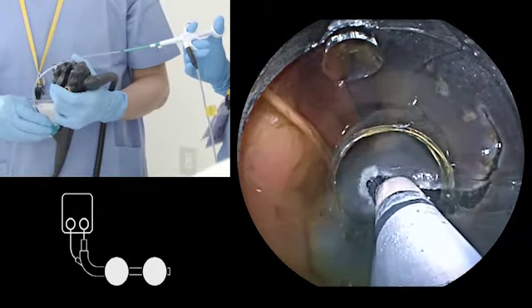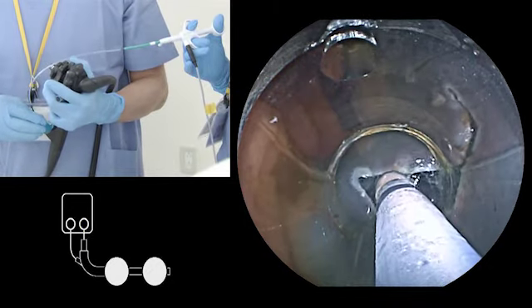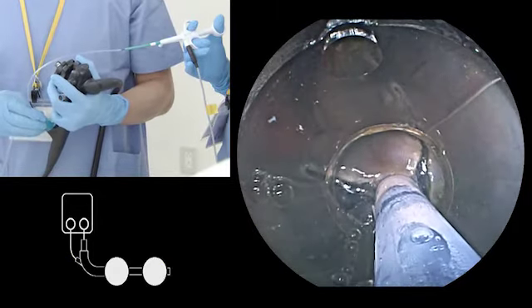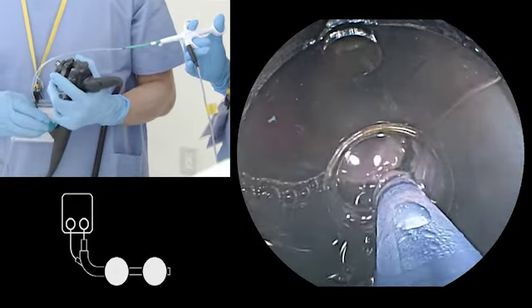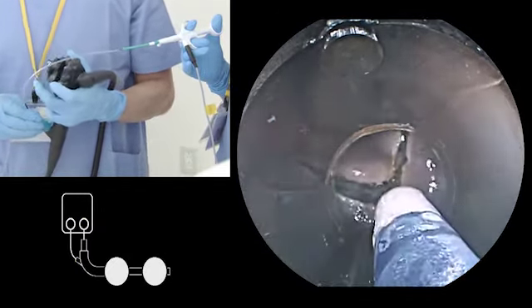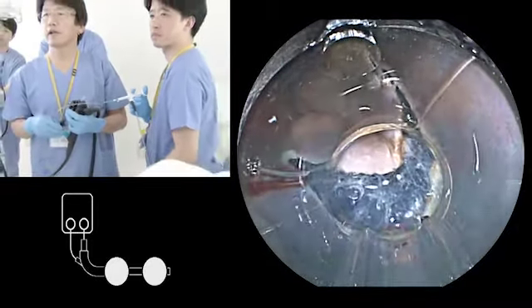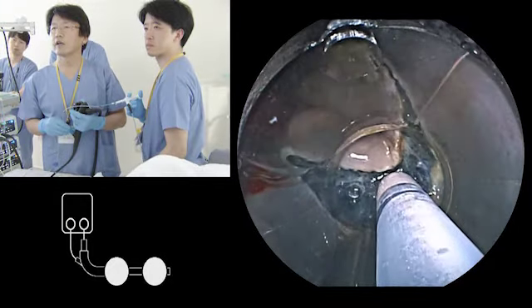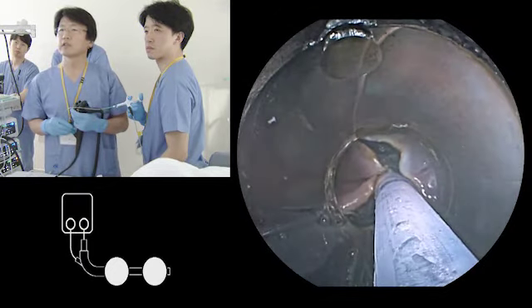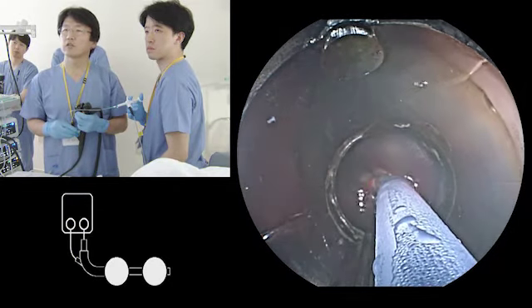But at the beginning, I just use the knife. The sheath of the knife is placed right below the mucosa, and move the knife parallel. And just shallow dissection is good enough, okay, because this is still a normal mucosa. And then I go in and I dissect, but it's just shallow. I don't go deep yet.